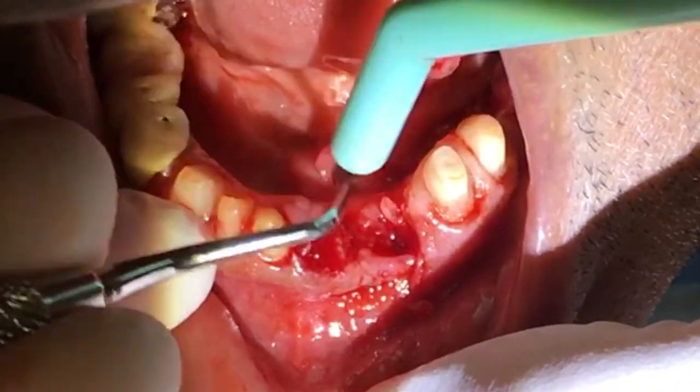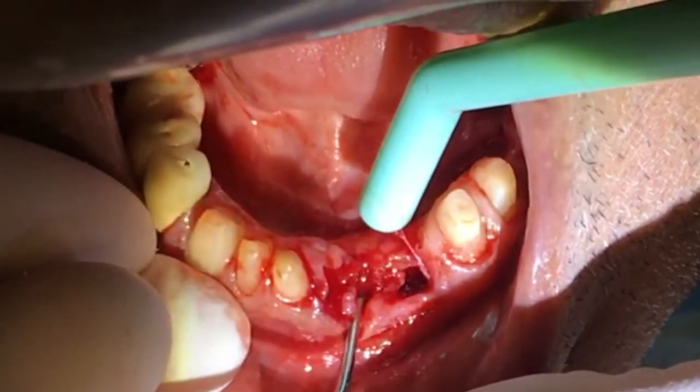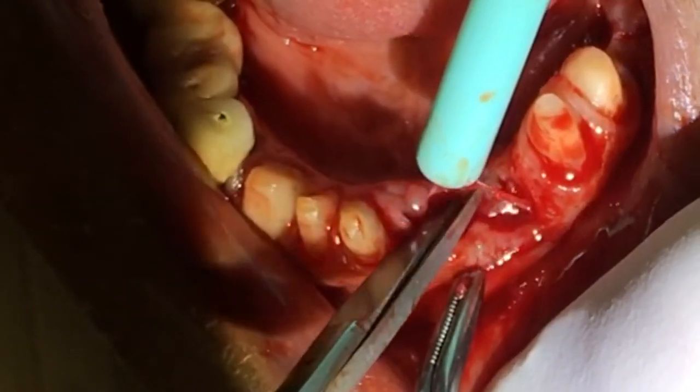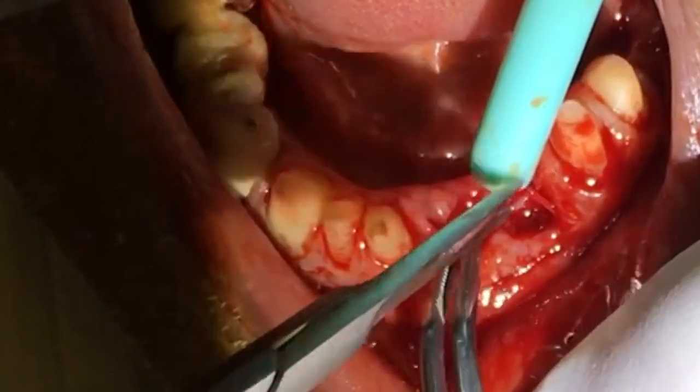After we're done scaling out all of the residual granulation tissue, we also cut out some of the excessive tissue as well. You can see there are some flaps of tissue, and we just go in and excise those out with the scissors.